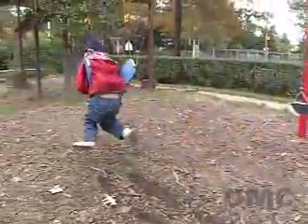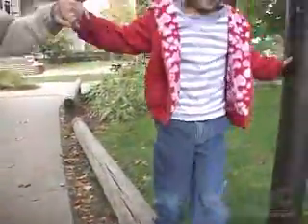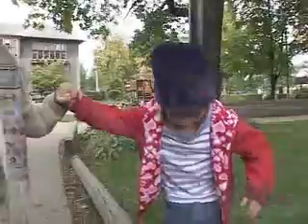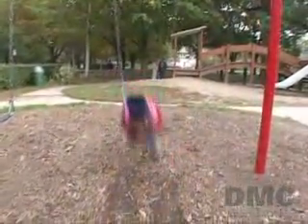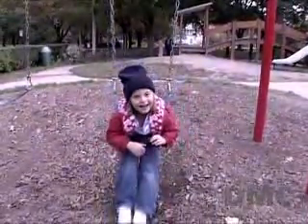Trinity Ashton has congenital heart blockage. She was only 3 years old when a pacemaker was placed in her chest. But then, one of the lead wires that connect the pacemaker to the heart was broken by her vigorous play. She faced having the pacemaker replaced with surgery that would open her chest.